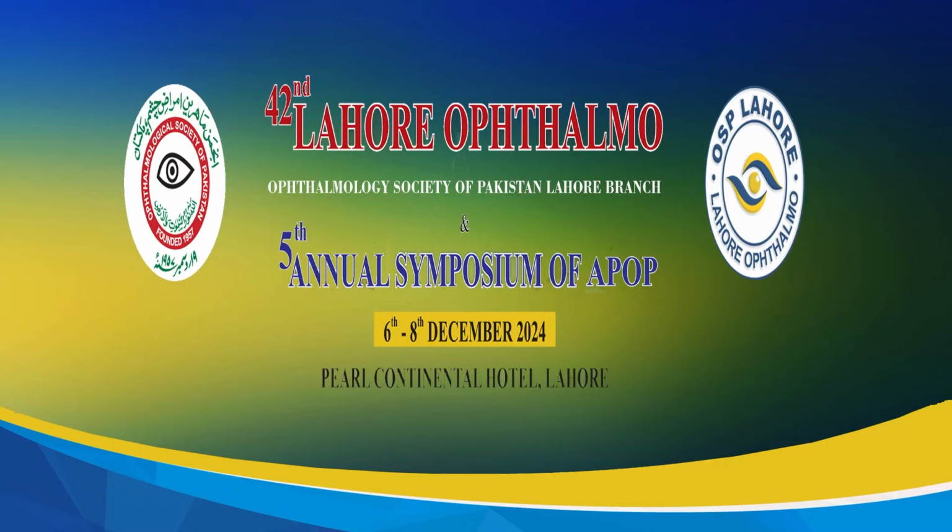You have to do peripheral laser. That peripheral laser will protect the retina very well. और उसके बाद वो contractions वगैरह उसके काम नहीं आती. And that is one thing one should keep in mind. If you're doing a proliferative diabetic vitrectomy, you have to do a good PRP during your surgery.